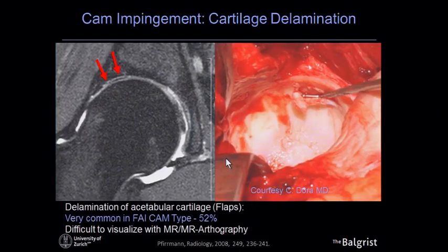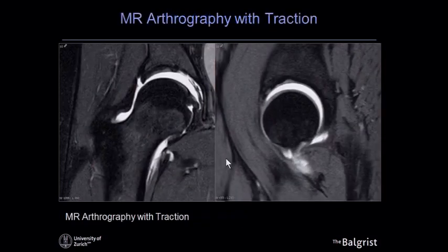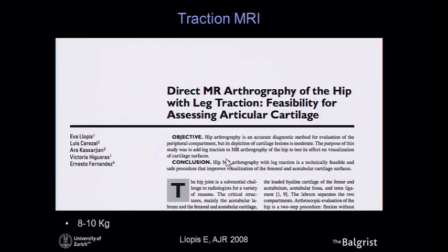To further improve cartilage imaging in the hip, one major problem is delamination of the acetabular cartilage, where the cartilage is pushed against the subchondral bone and the delamination is not visible. This led to the concept of traction imaging: by injecting contrast and opening the joint with traction, the contrast enters between the cartilage layers exactly where we want to see it, nicely delineating the cartilage surface.